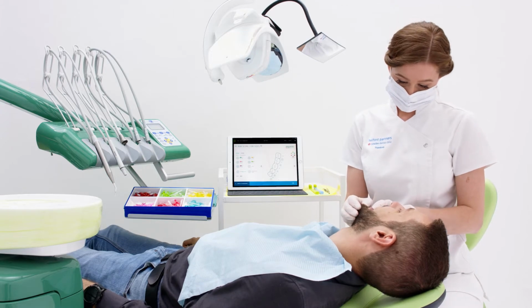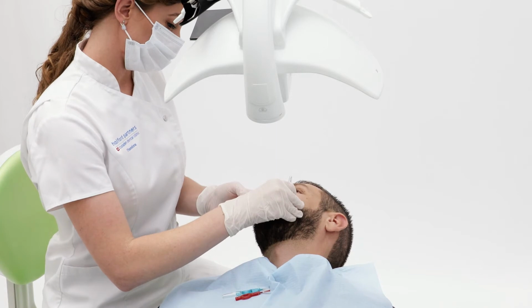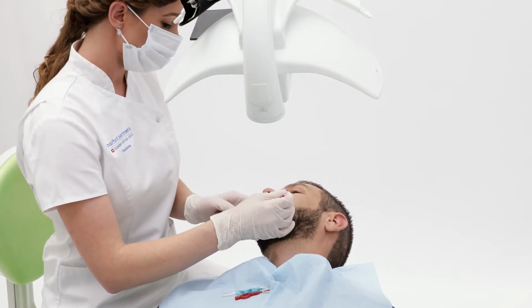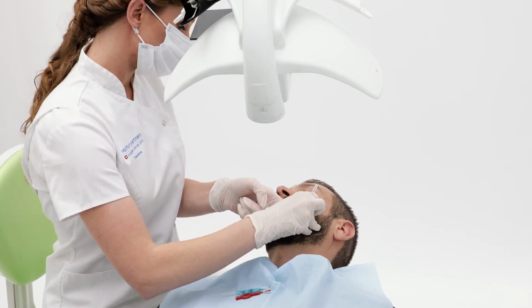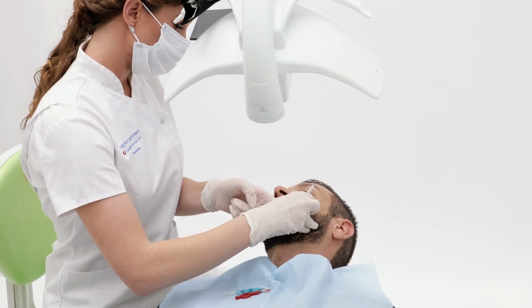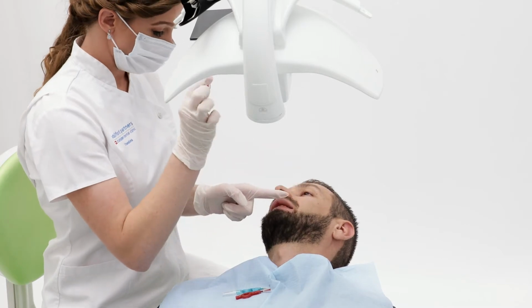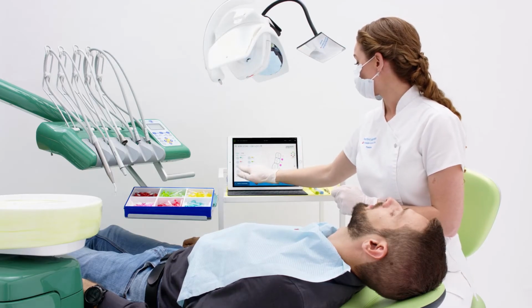Moving on to the lower arch, I complete the Bob assessment with the interdental brushes selected, inputting all information as I move along. I remind Edward to look into the mirror when I am using the interdental brush so that he can be reminded of the technique recommended.